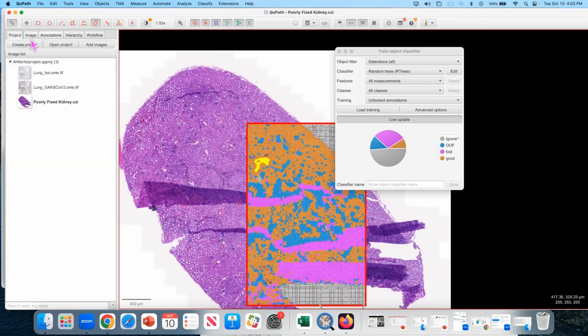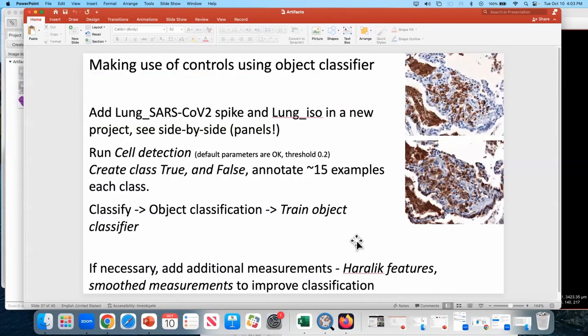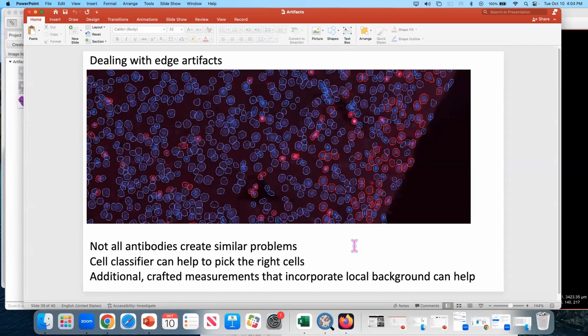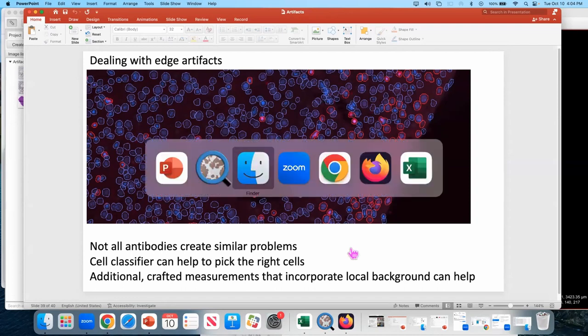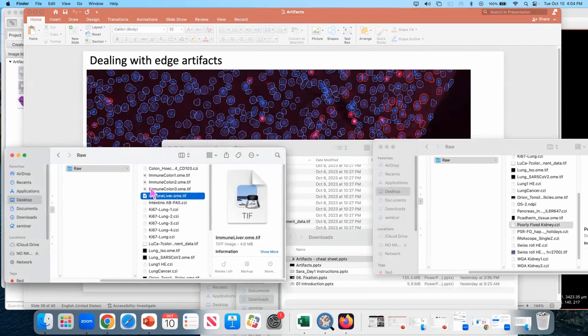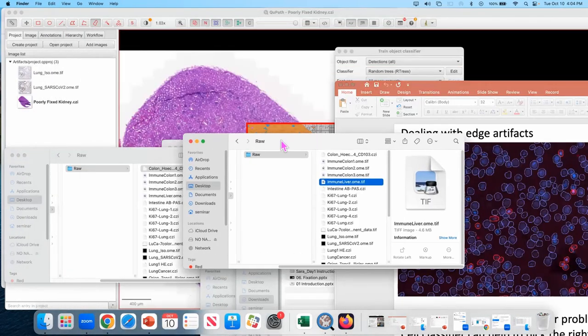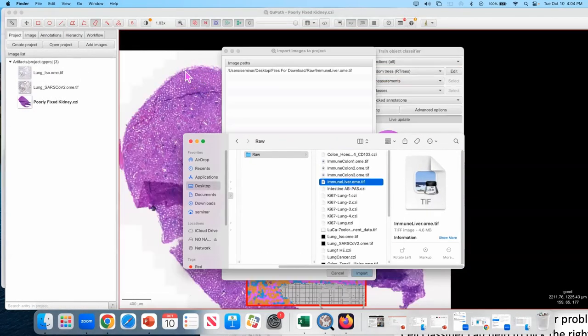Thank you. So we are going to go to our last image that I wanted to show you, which is dealing with edge artifacts. It's the one to the last. And this one is based on the image called Liver Immune. So go ahead and drop it into QuPath.